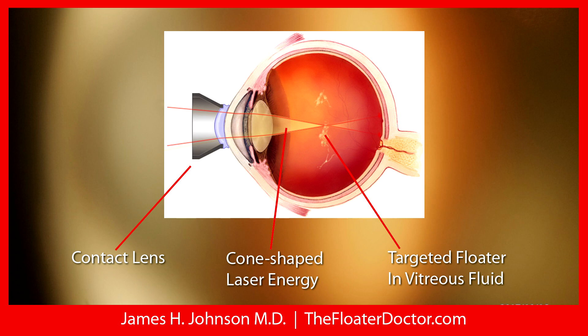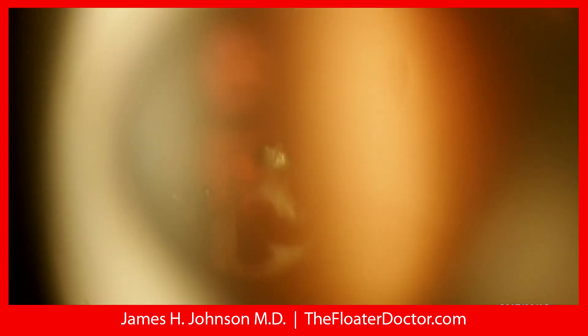I'm going to switch back to live treatment and describe what's going on. To orient you, we're looking through a big dilated pupil. The light source that illuminates this ring is shifted off to the left, which is why there's a little bit of glare and reflection there. You might appreciate there are two red beams I use for focusing — using that cone model of energy, the red beams run along the top and bottom of the cone. When those two red beams are focused on top of each other, coincidentally, that's where my laser is absolutely focused. The retina is further back and very blurry. I can tell where I'm located because I can't see any detail of the retina, retinal blood vessels, or optic nerve. Using binocular stereoscopic vision, I know where I'm located — right about in the middle part of the vitreous.